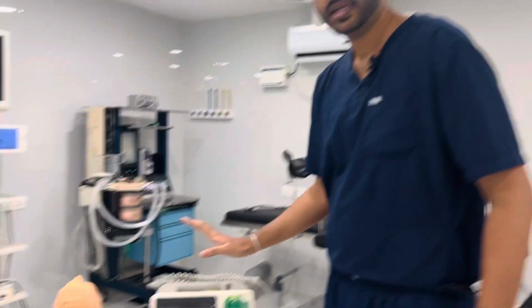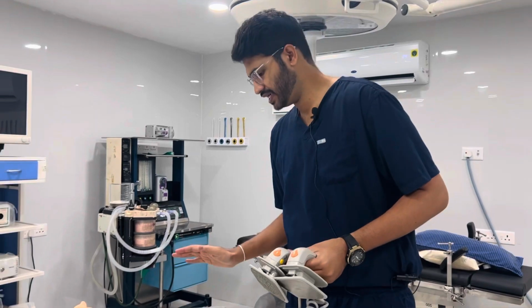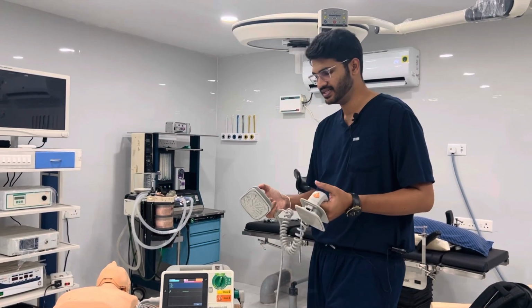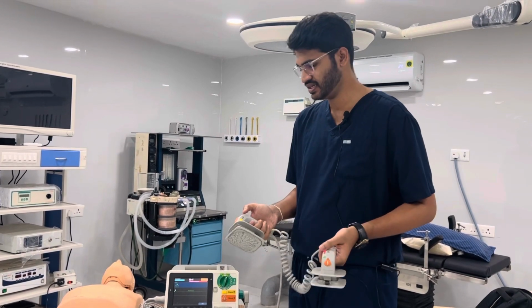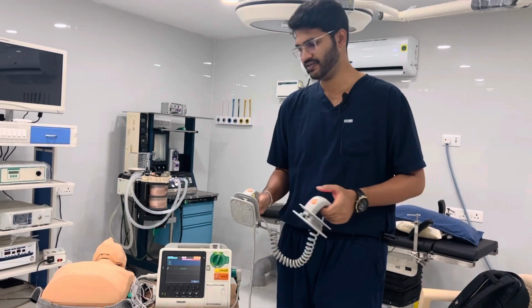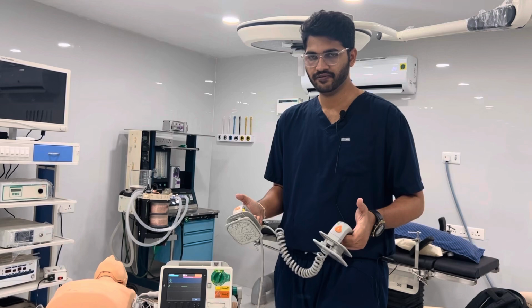Now we'll talk in detail about the defibrillator. Going back to the defibrillator, what you see is the defibrillating machine. What I'm holding in my hands are the paddles. One we have to keep at the apex and one at the sternum of the patient. If you have any doubt, there is a picture on the paddles in every hospital, on every defibrillator, so that you won't get confused.